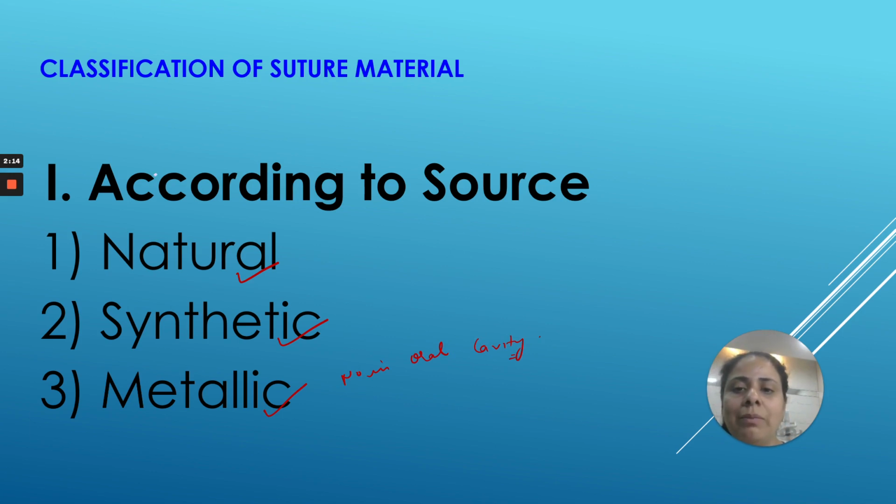So mainly we'll be focusing on these two types, natural as well as synthetic, as far as the oral cavity is concerned. You should always prefer synthetic sutures, because there are a lot of good options available in synthetic. Natural, I have used a lot of natural suture materials in my career, and I will tell you what I faced and how they were.